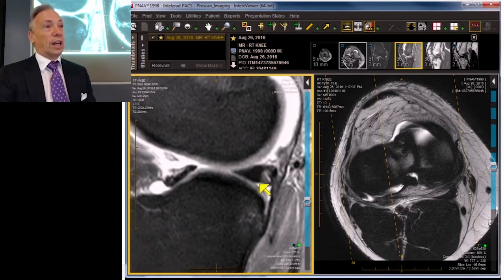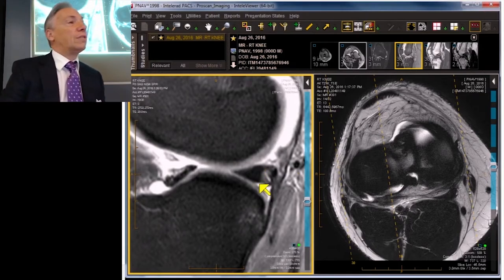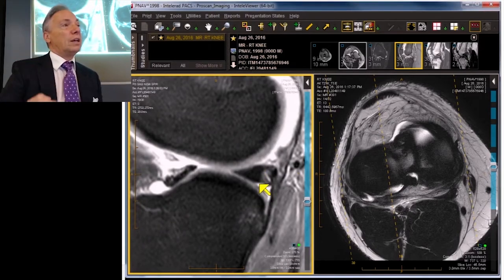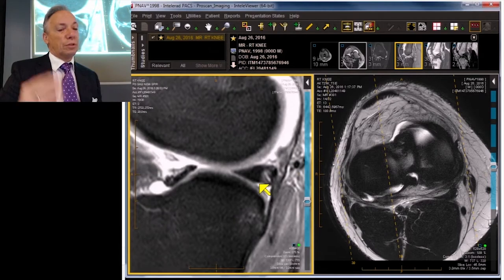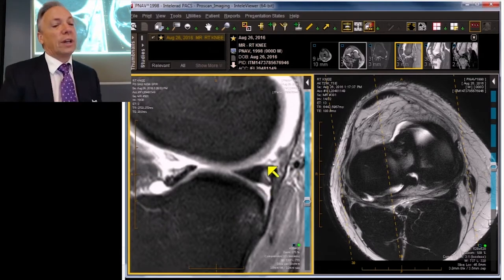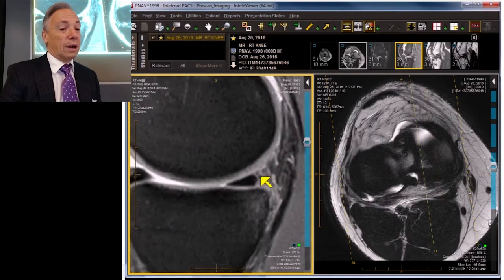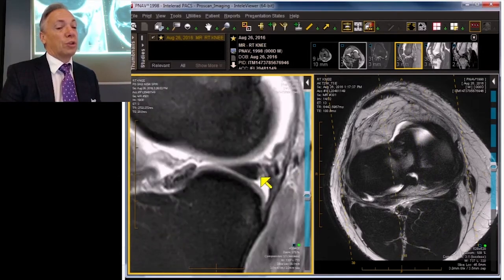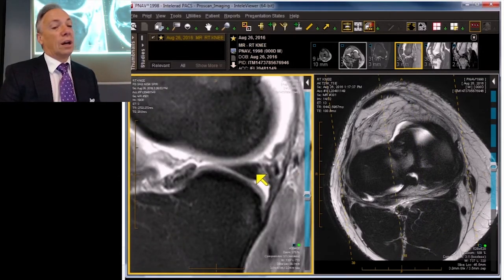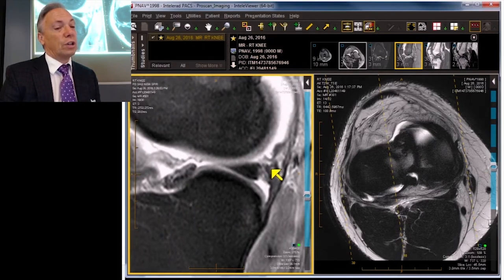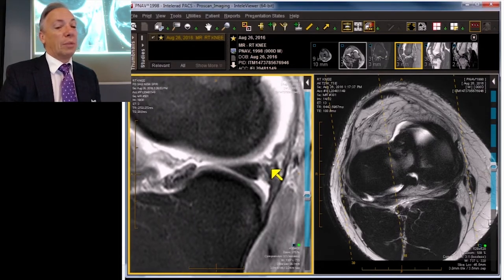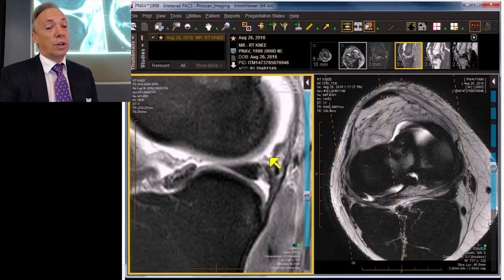You can see it reattaches right back into the triangle. So in this case, we have injured the posterior medial meniscal capsular attachment with a vertical sliver tear on the medial side — there's our sliver tear — and on the lateral side we have disruption of the menisco-popliteal and capsular fascicles posteriorly, along with an injury of the popliteal fibular ligament and a frank tear of the posterior capsule.